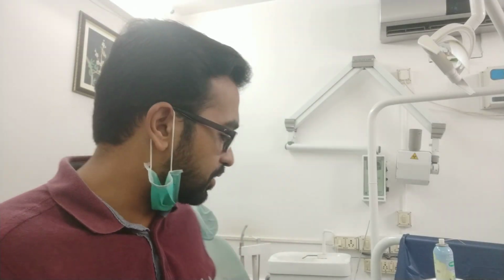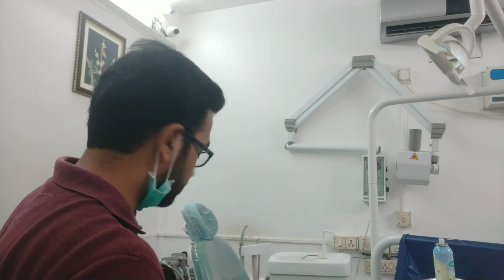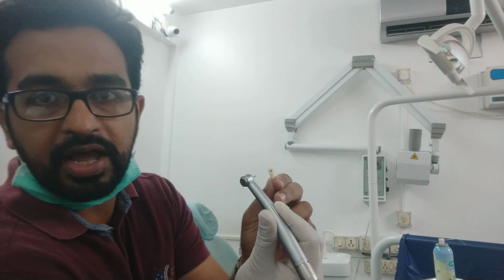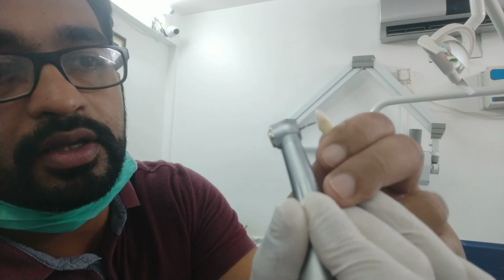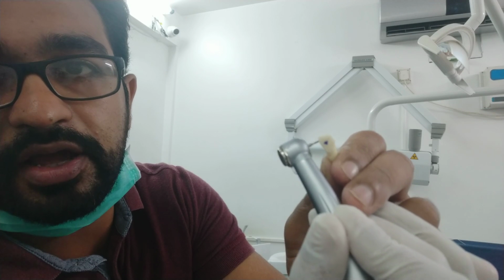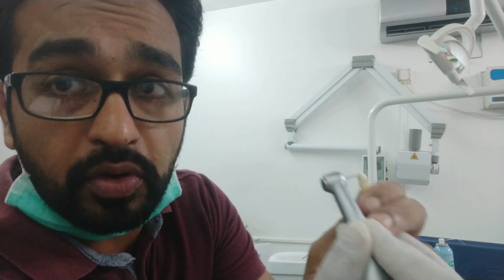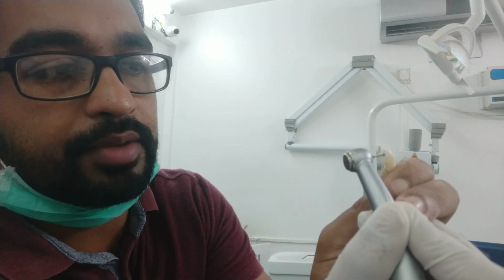Okay, so we'll start with this. First of all, you need to have this basic aerator and all. So this is my aerator. Oops, water. So I am making a small ditch hole, if you can see, at this point which I have marked. The access opening is only this much, and you have to do it on the patient, right? So I am just holding it and using the burr.